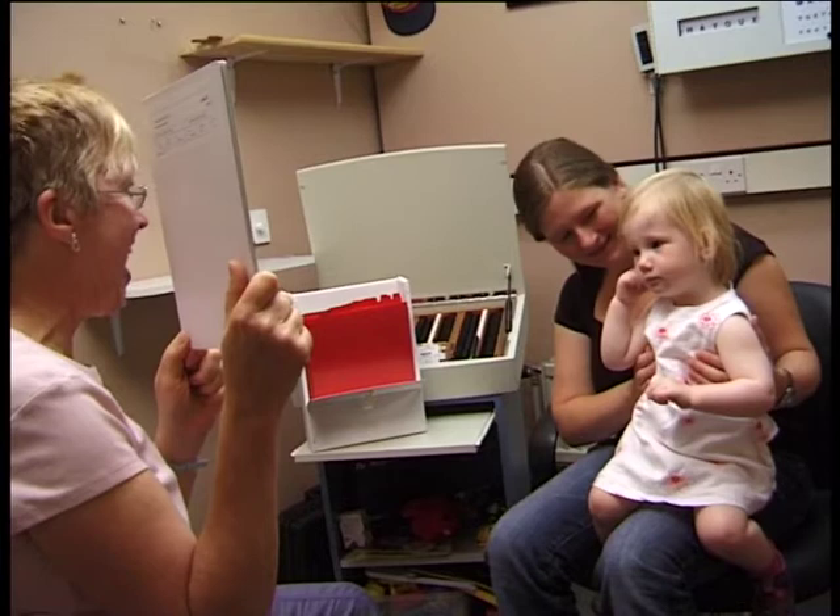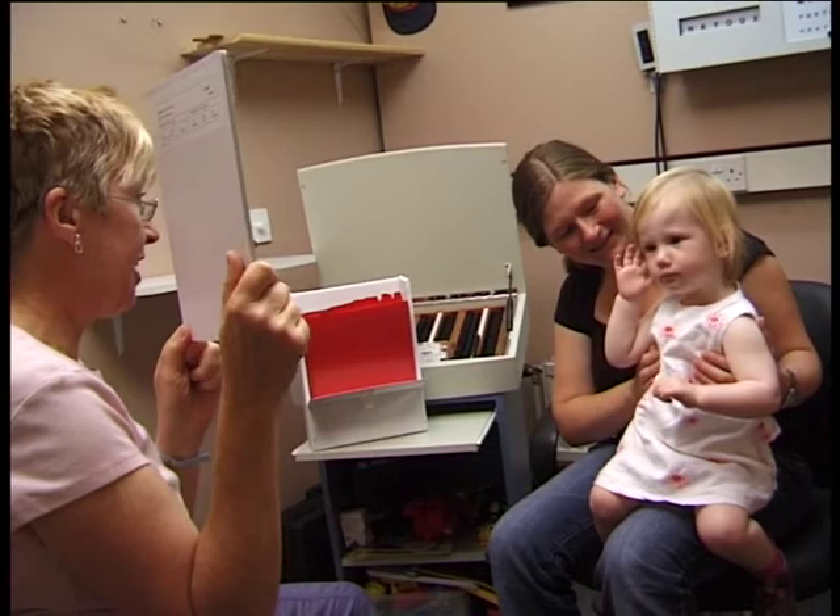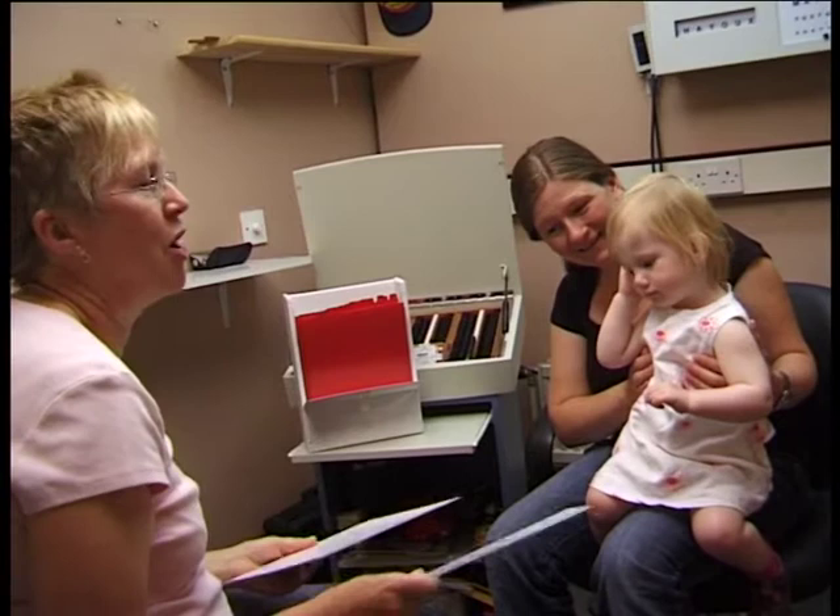If we're showing these cards to a child like Arwen, then while she can see the picture she's going to want to look at it, especially if we make the procedure enjoyable. When she can't see the picture, she's not going to look at it.